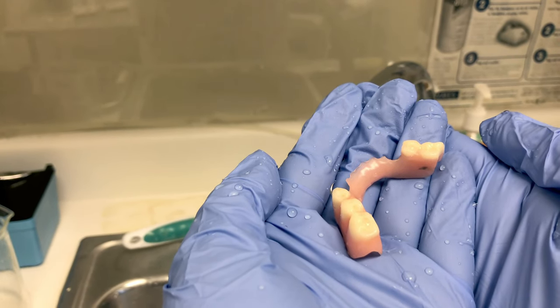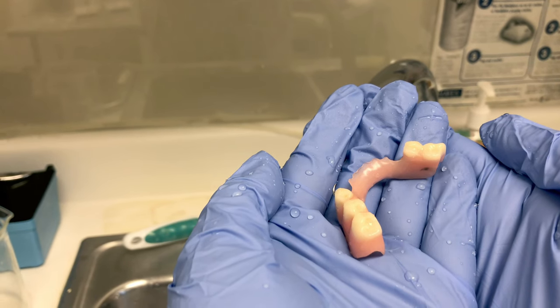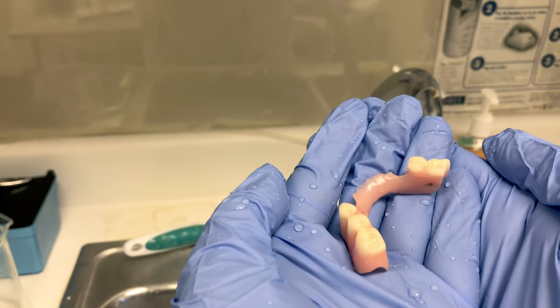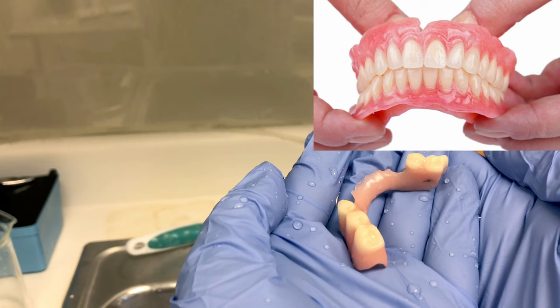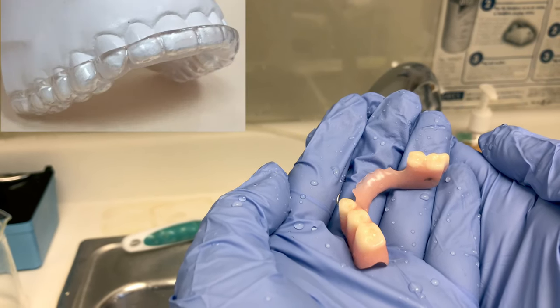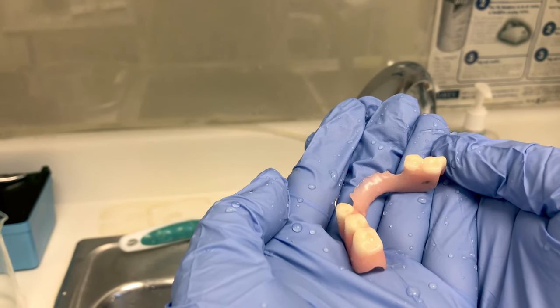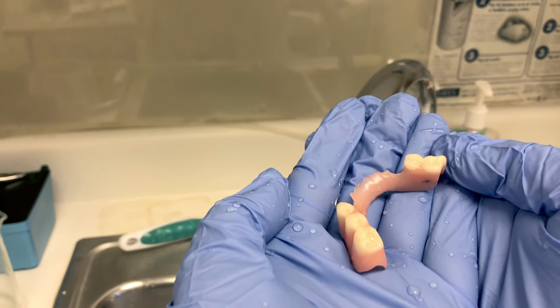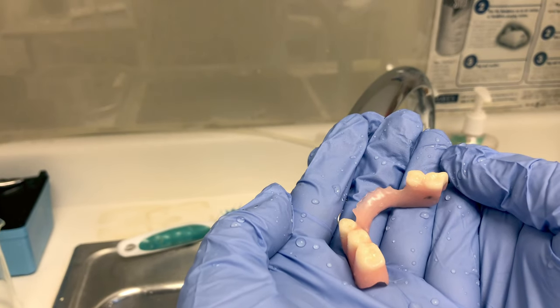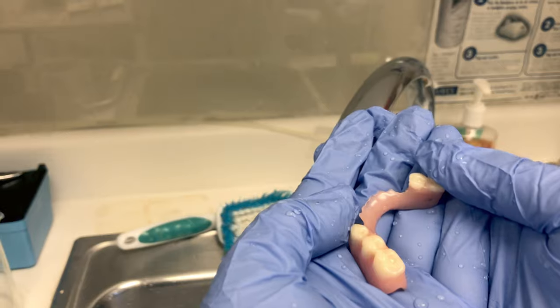Hi everyone! This video will demonstrate how to properly clean a removable appliance. For your patients that wear dentures or partials, or even patients with mouth guards or bruxism guards, we give these items a courtesy cleaning when the patient comes in for their dental appointments. This will help remove any buildup that may be stuck on the appliance.